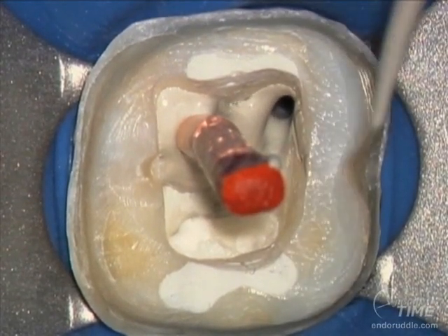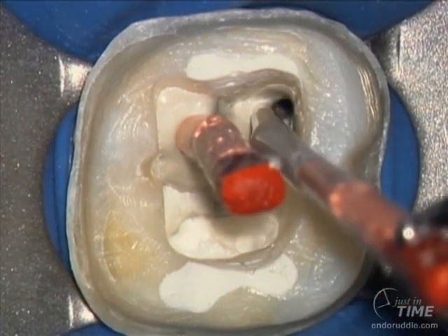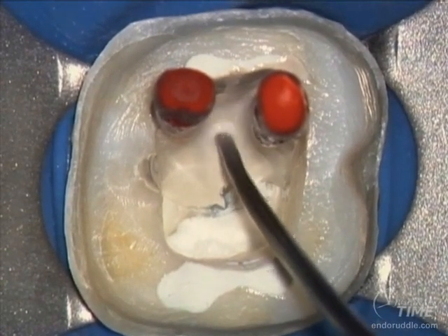If the cone is still uniformly buttered, seat it back. If you saw a denuded area, simply rebutter the cone to make sure there was sufficient sealer. Again, the sealer is in place and we're ready to pack.